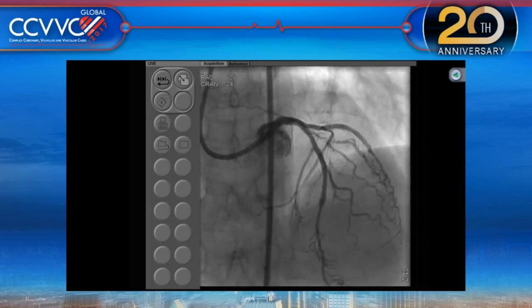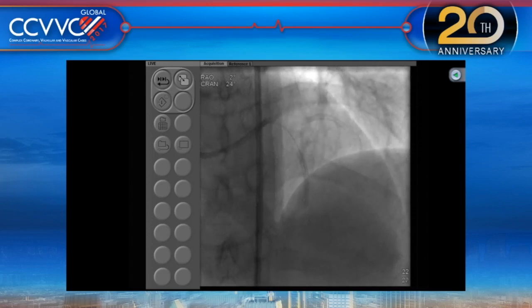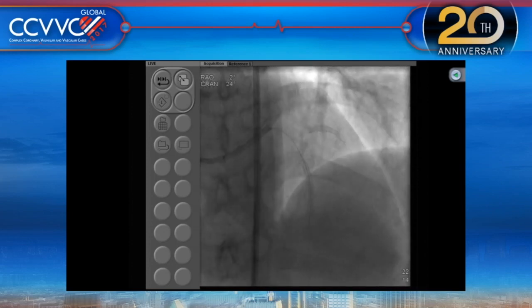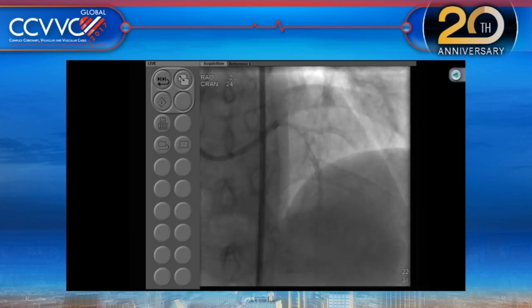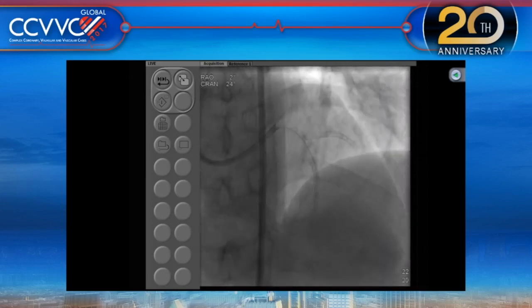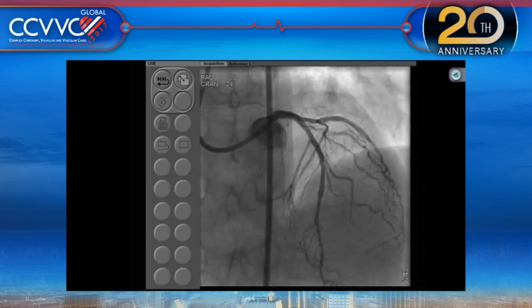So we are ready, Anu is ready in the other room, but this is simple and straightforward, because what I wanted to emphasize is only one point, and we don't have the data to support it clearly: for the side branch, using the Flextome or AngioSculpt, meaning atherotomy, to avoid that recoil which is seen many times when you put a stent across, is a trouble. Therefore I preferably use it in a tight lesion of the side branch, usually the Flextome, and if there is no disease, I just leave the wire. So with that note, I think it's a reasonable case.